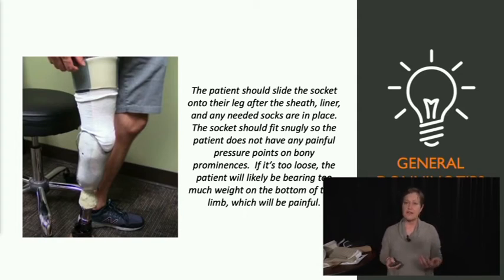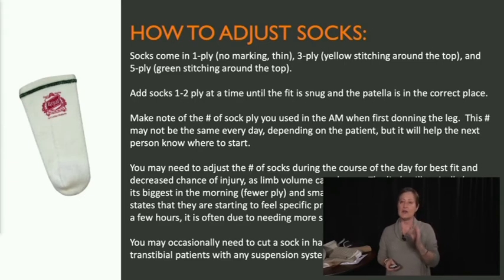I always start a therapy session, especially early on in their rehab, with them doffing their leg, and then I can see how things are going. Number one, I'm looking to see if they know how to do it correctly, but I'm also taking a look at the health of their residual limb so that I can give them some points about whether or not they need to add socks, etc. So how to adjust the socks.